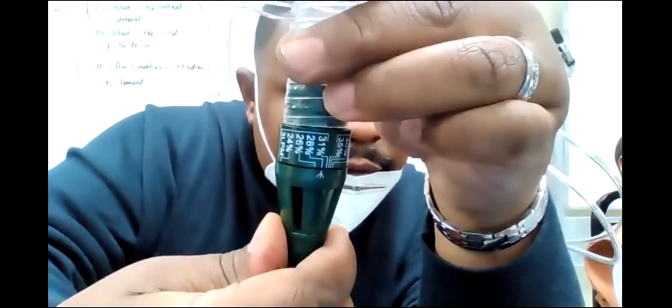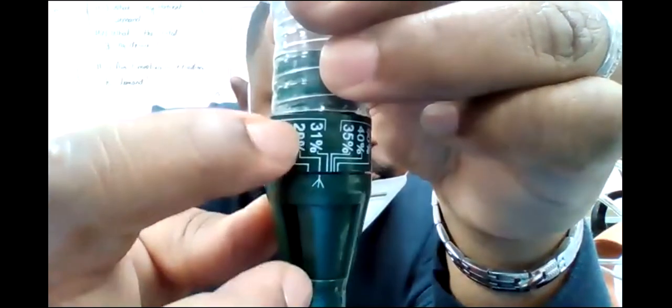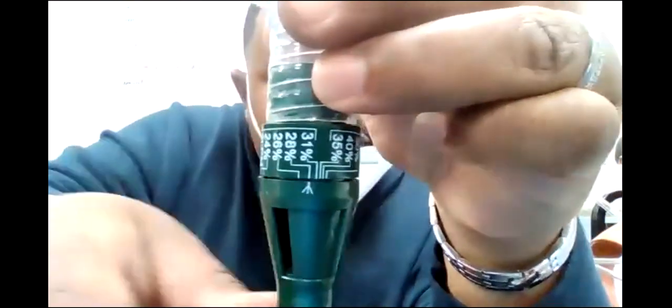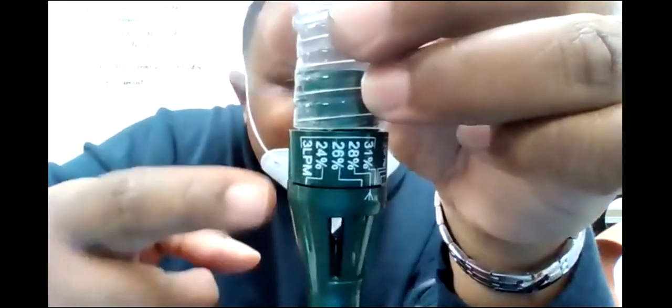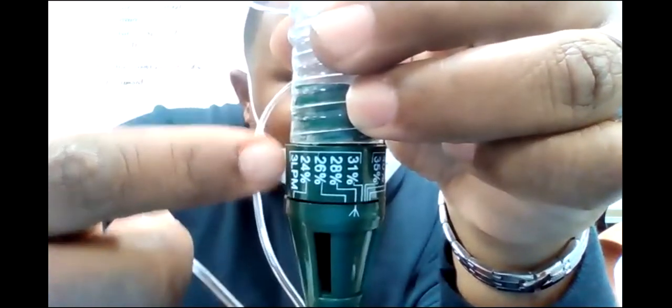So say I want 28%, see how 28 comes down and curves and goes down? Well, my arrow is right there on the one that leads to 28%. See that? So if I have this on here, as long as I have it turned to how many liters? 3 liters. So all of these FiO2s are governed by the 3 liters. These FiO2s are governed by what? 6 liters. That's all it is.